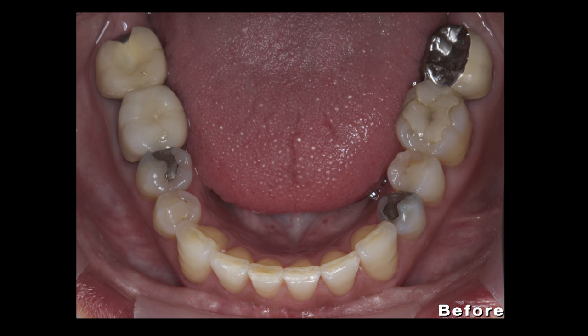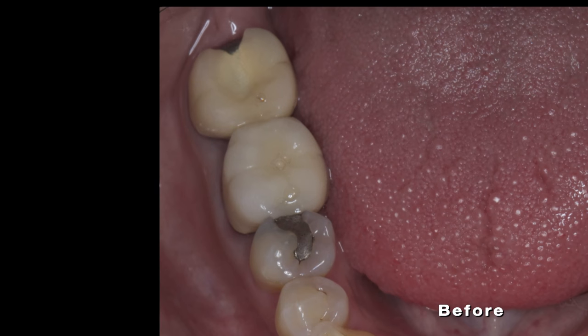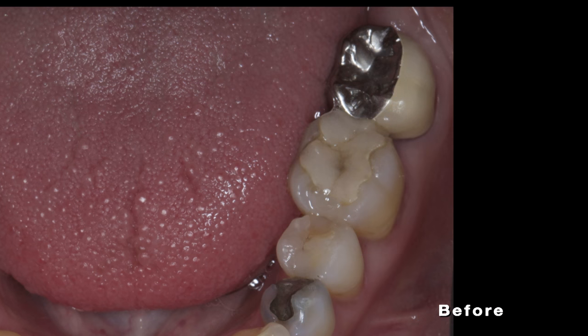Traditionally, porcelain fused to metal crowns are used to restore badly broken or endodontically treated teeth to protect the remaining tooth structure. PFMs may also be responsible for maintaining occlusion, as the crown on number 18 tried to provide with the presence of the metal surface. Here we can see how the effect of the masticatory forces chipped off porcelain distal on 31 and how aesthetics was sacrificed for strength with the crown on number 18.